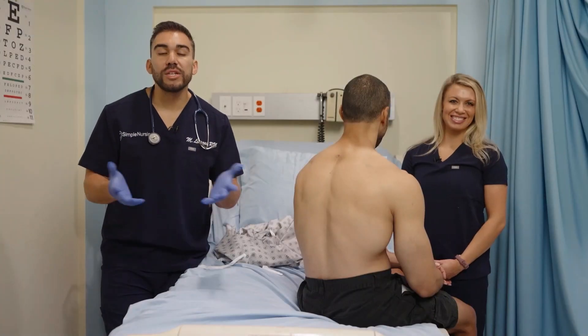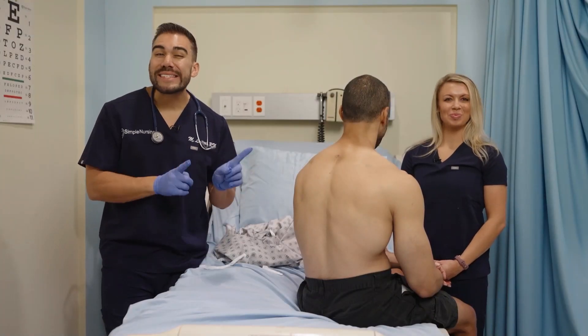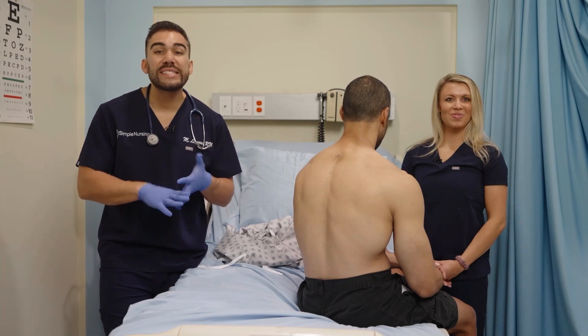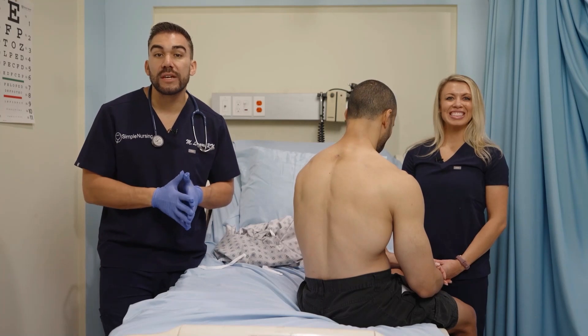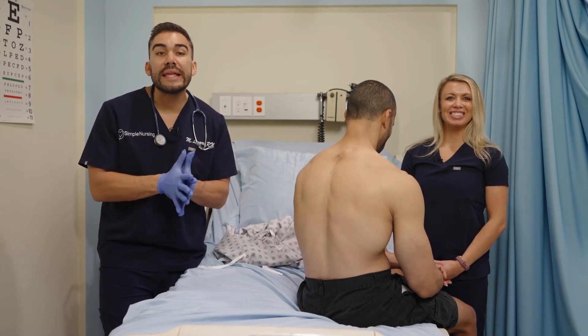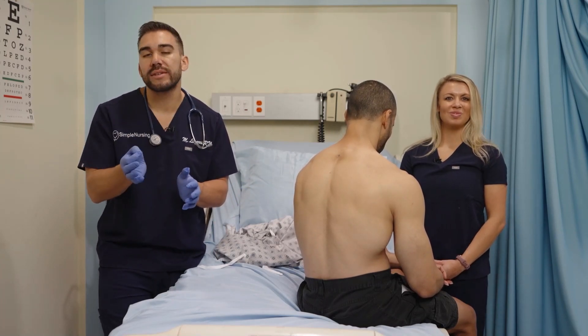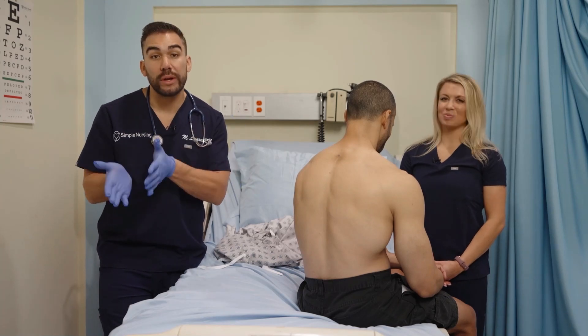Now we're going to listen to lung sounds, what's known as auscultation. We're going to listen for vesicular, crackles, wheezes, stridor — really anything going on inside the lungs. We're going to show you a quick assessment of how to do it. Always remember, we're going between the ribs in the intercostal space, meaning in between the ribs.